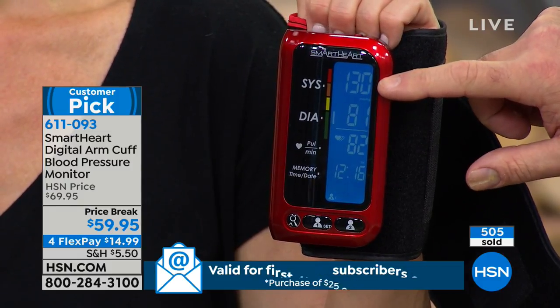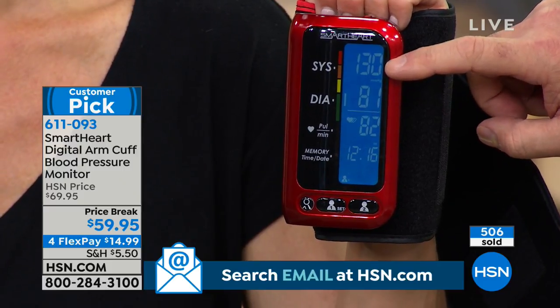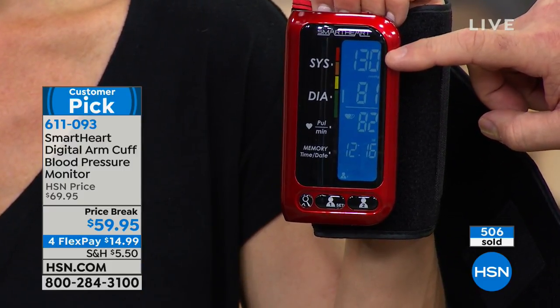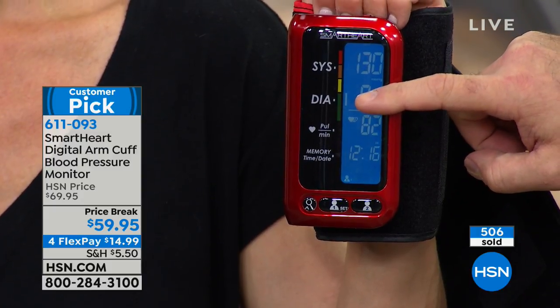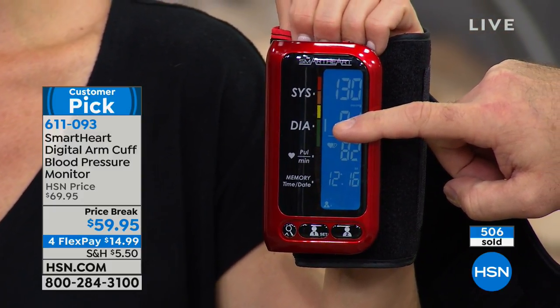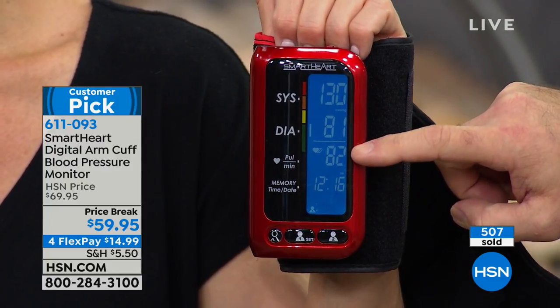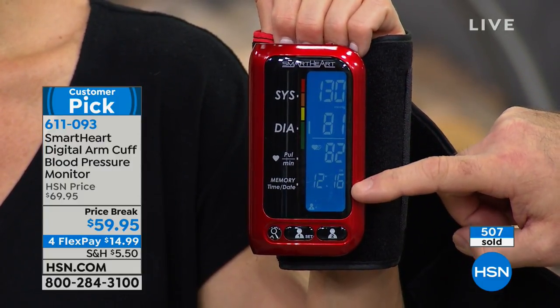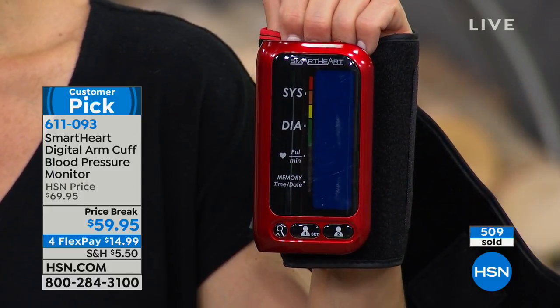Take a look — Jennifer's reading right now is 130 systolic over 81 diastolic. If you don't know what that means, check that hypertension indicator: she's in the green. And 82 is her heart rate. Again, time and date stamped, for up to 250 readings in memory.